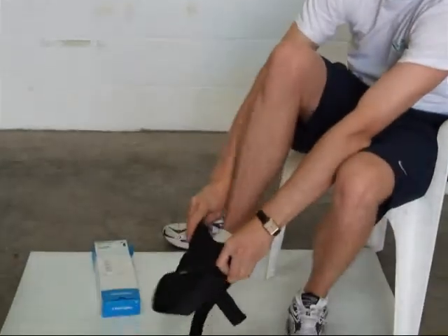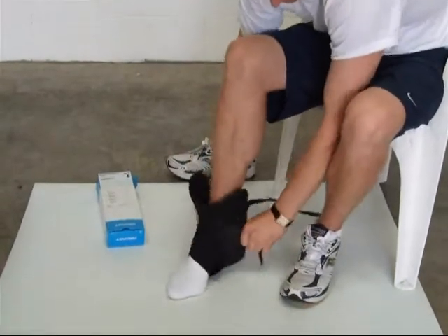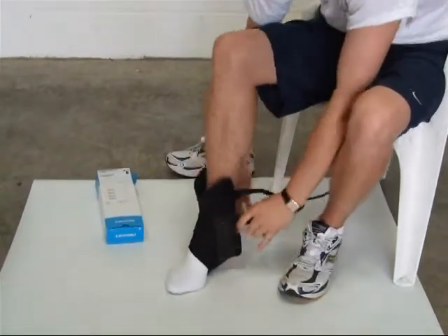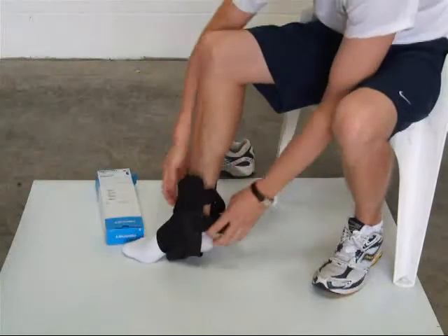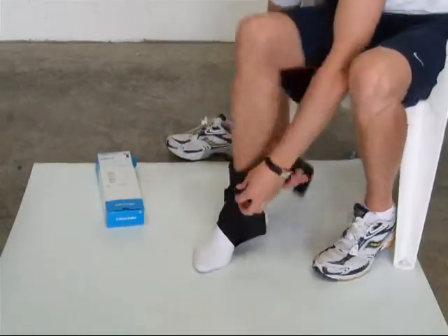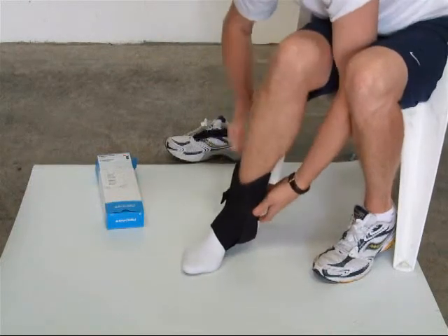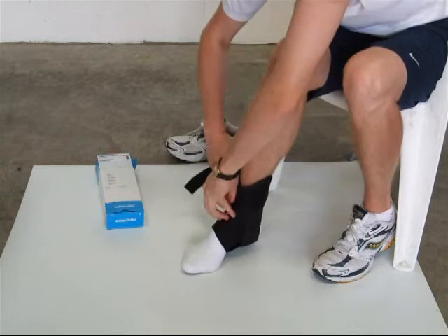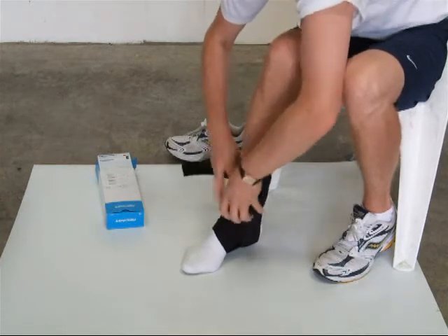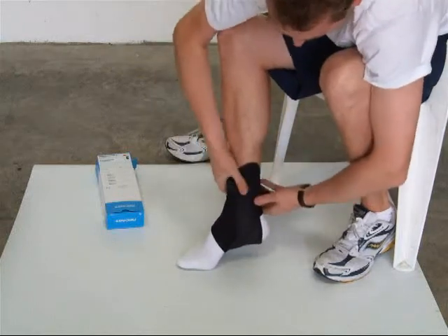You simply push your foot through and make sure the splints are in the right place. On the back there's a Velcro strap which you do up, then you pull the wrapping tight and simply Velcro it up.